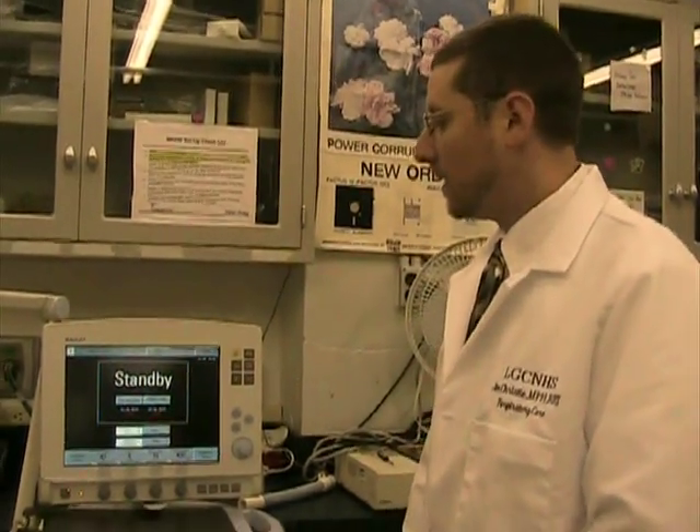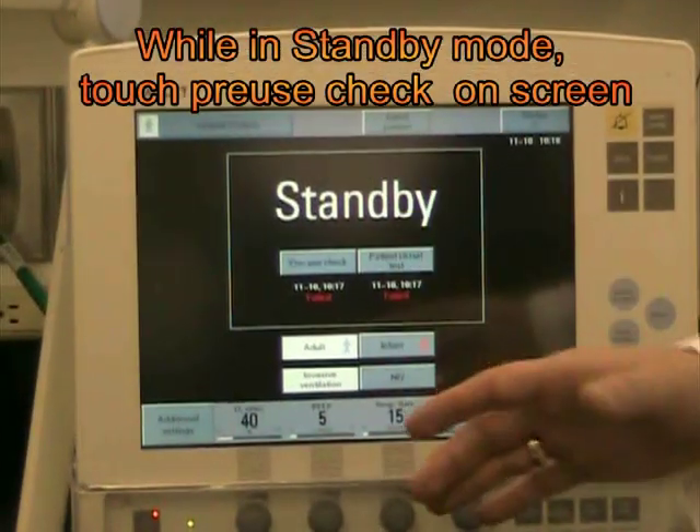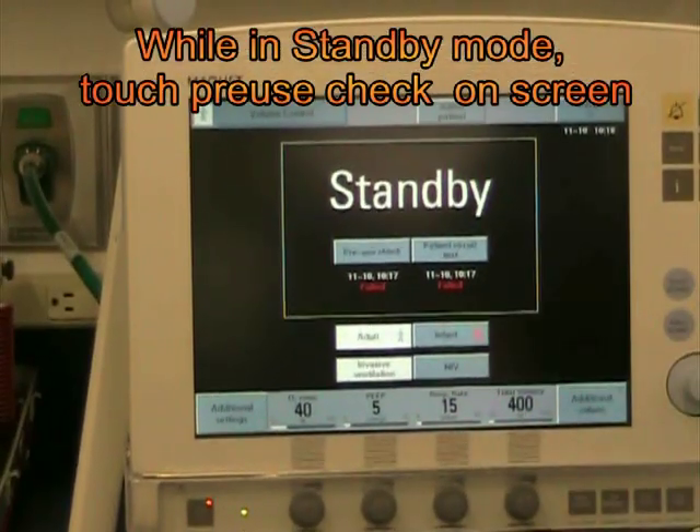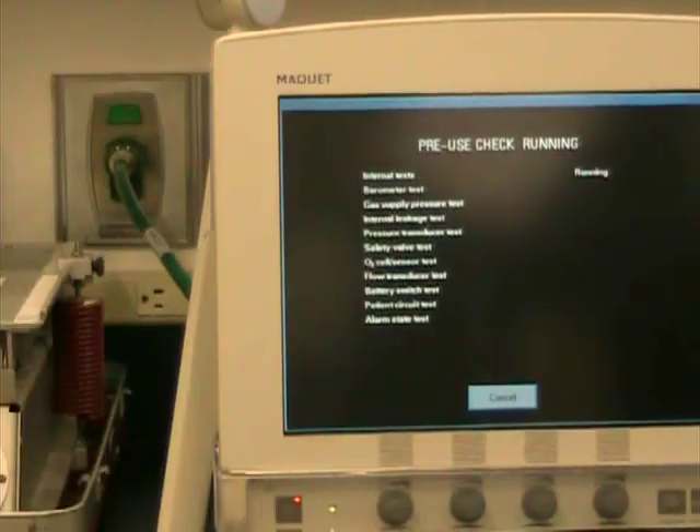This video is going to instruct you with a pre-use check of the Servo Live Ventilator. We'll begin by touching the pre-use check button. Most of the test will conduct on its own and it will ask you to do certain things throughout. We'll start with the pre-use check button and it kicks right into the test.